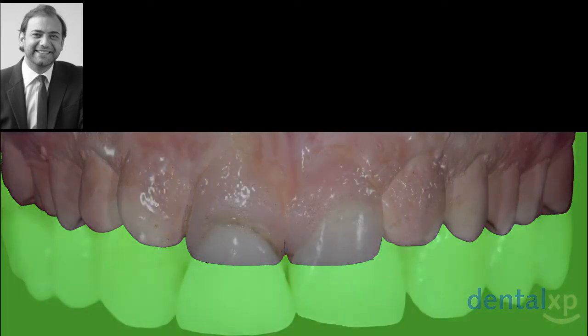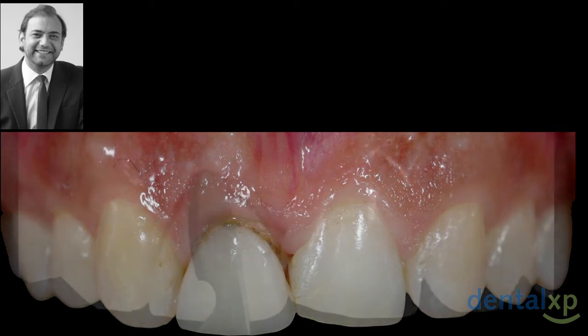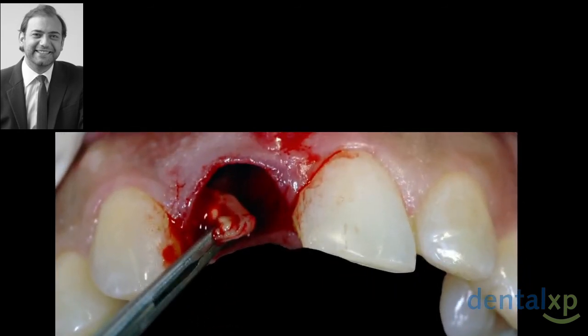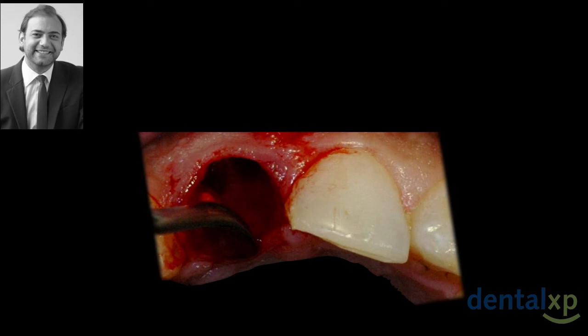So we start, again, you see we're dealing with thin tissue, the same procedure. 15C blade, we remove the tooth. You will see the defect we have on the distal aspect this time. Antibiotics help prior to surgery. We know this from endo, in order to remove the defect in one piece at time of surgery. And we have 2 craters, one from the defect and another from the alveola.